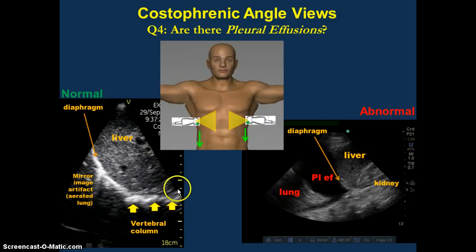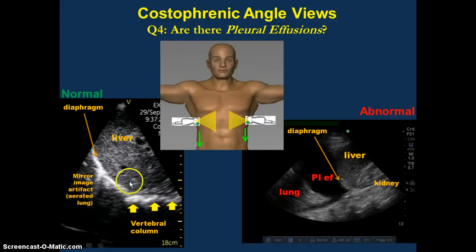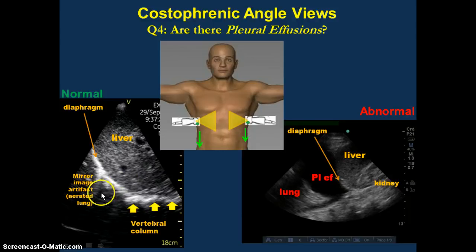This side correlates with down towards the feet, and this side is up towards the head. Closer to the probe over here is lateral, and deep to the probe is medial. On the right-hand side, you're going through the liver and then hitting the vertebral bodies as they move midline — those are these white lines here. In between, you see this bright white line — that's the diaphragm. With normal aerated lung, you get a mirror image artifact where it looks like there's liver on the other side of the diaphragm. When you have a pleural effusion, you get this black fluid above the diaphragm, and you can clearly see the lung outlined by this black fluid.